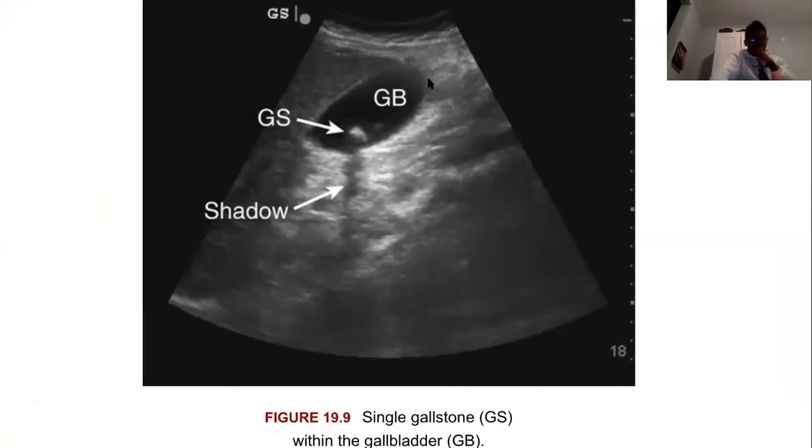Well, fundus is the... What did I say is the most anterior and inferior portion of the gallbladder? Remember the sad sunflower? Yeah, I remember that. What is the most anterior inferior portion of the gallbladder? There's a head, fundus, and a neck, right? Yeah, it's the fundus, right? So where's the fundus?